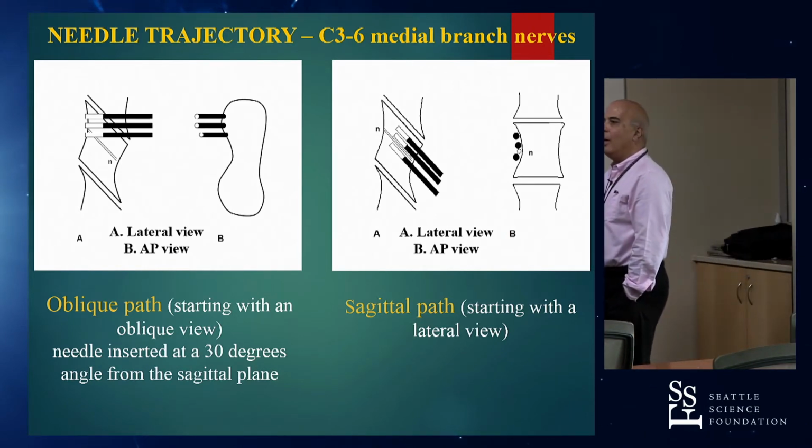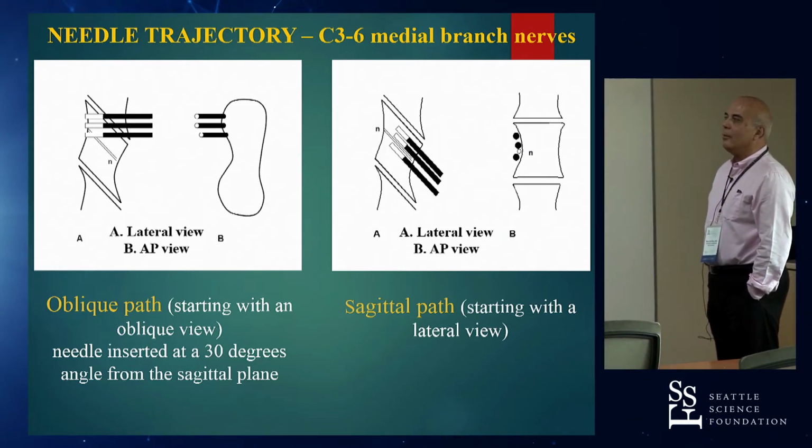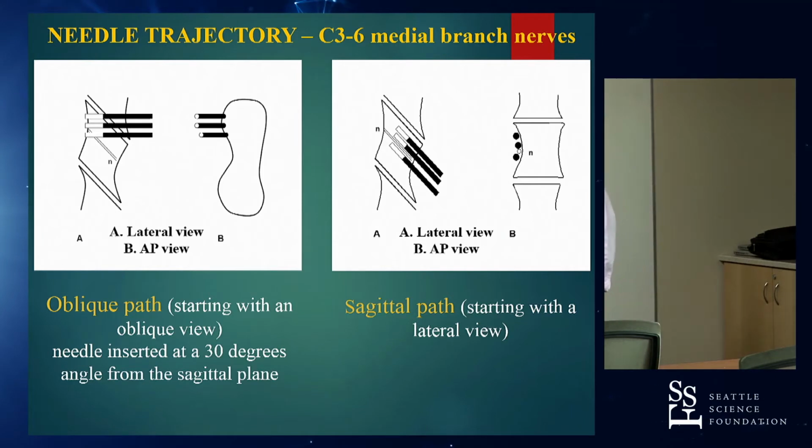That means that you can start your procedure placing the needle on a lateral view and placing the needle parallel to the plane of the corresponding cervical facet joint.